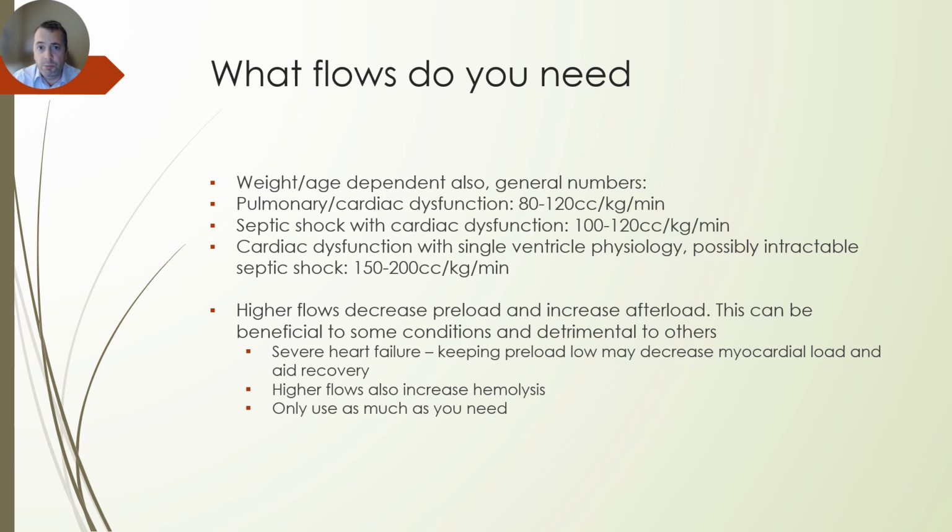Higher flows do decrease preload and increase afterload. This can be beneficial to some conditions, detrimental to others. For example, in severe heart failure, it may benefit you to keep the preload low, decrease myocardial load, and aid recovery. Higher flows can increase hemolysis, and so it's generally advised to just use as much as you need.